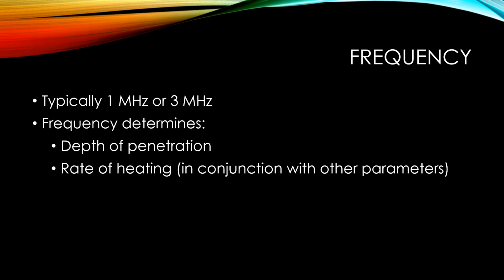The frequency you choose when you're doing your therapeutic ultrasound will determine 2 things. One is it will determine depth of penetration. 1 megahertz is thought to penetrate deeper than 3 megahertz. And frequency also determines the rate of heating in conjunction with some other parameters.